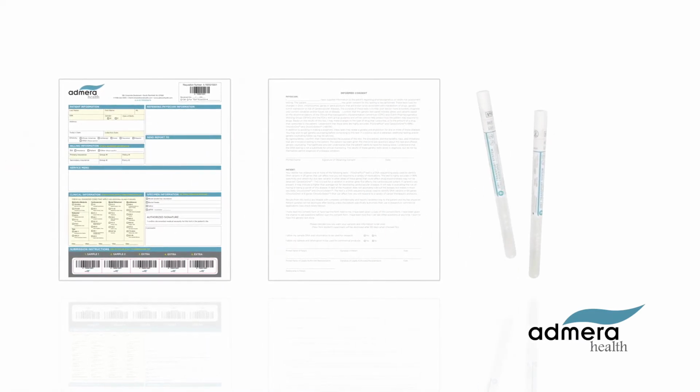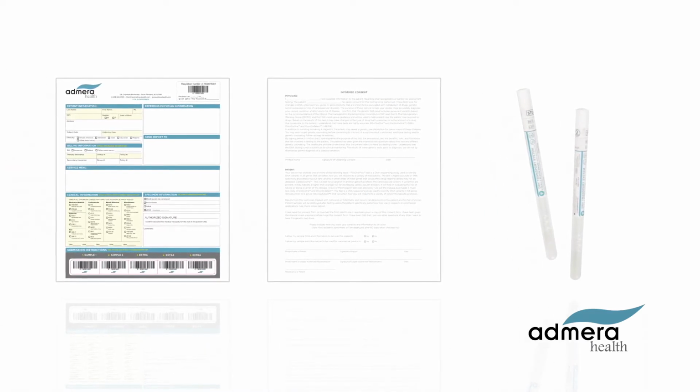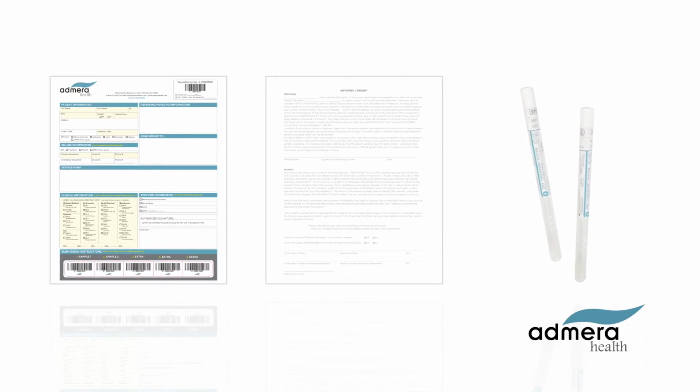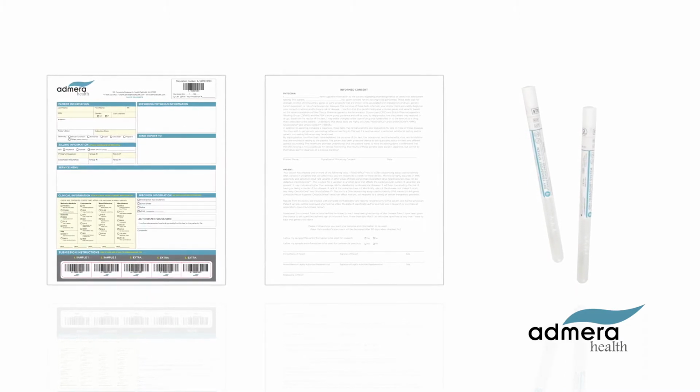The completed test requisition, signed informed consent, and 2 buccal swab sample tubes must all be submitted for testing. Please ensure that the requisition form is completed. Missing information will result in delays.